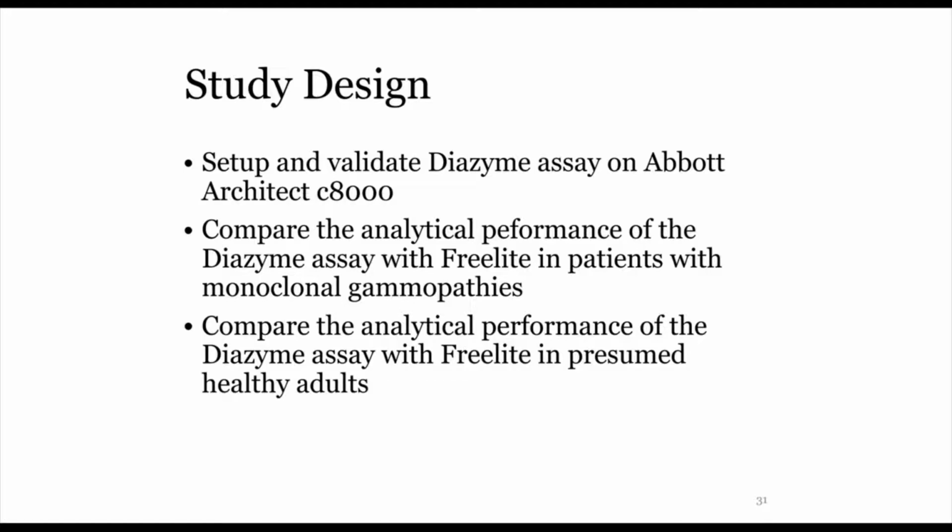In the next few minutes, I would like to share with you the results of a study that we conducted in our laboratory to answer the question of whether free light chain assay results are interchangeable with each other. In our particular study, we decided to compare the traditional gold standard for free light chain analysis, the Freelite assay from Binding Site, with the most recent addition to the market, the Diazyme assay.